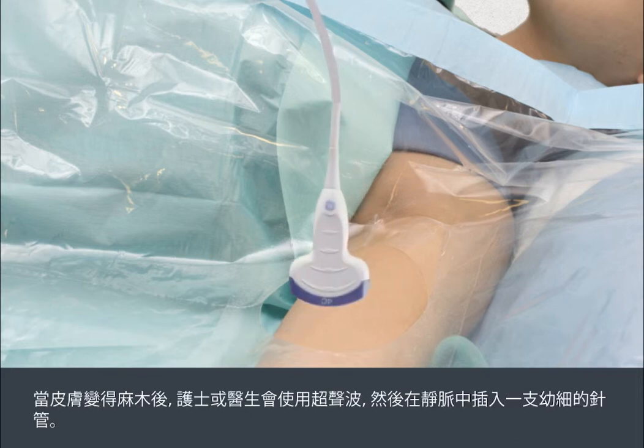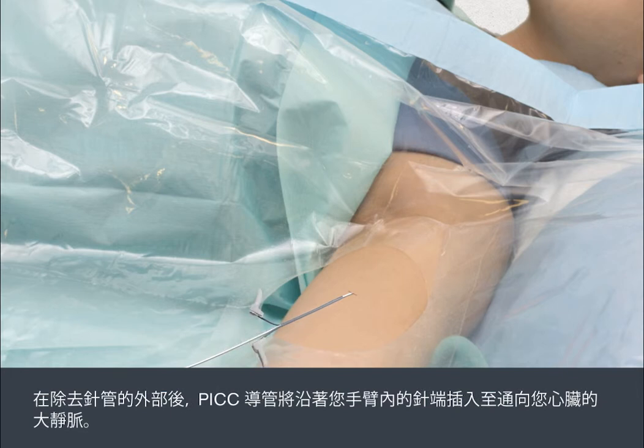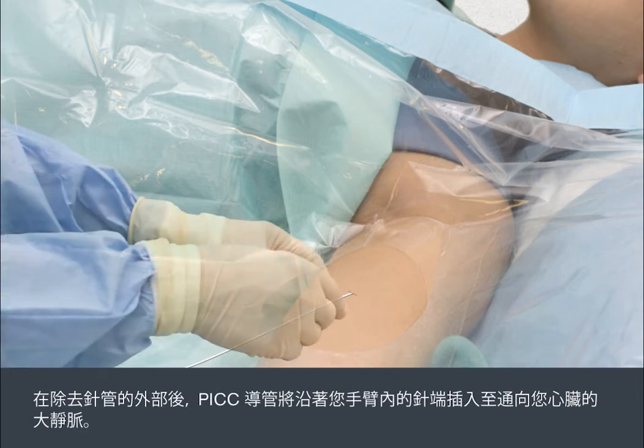Once the skin is numb, the ultrasound is used while a fine needle is inserted into the vein. The outer part of the needle is removed, then the PIC line is threaded through the tip of the needle in your arm into a large vein that leads to your heart.